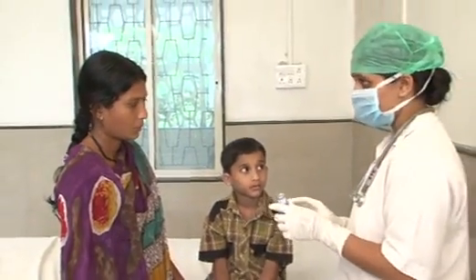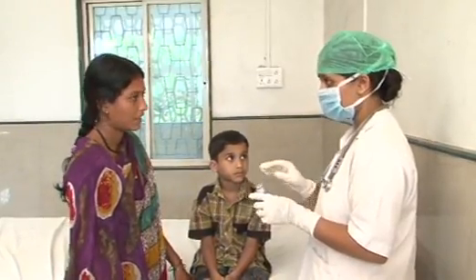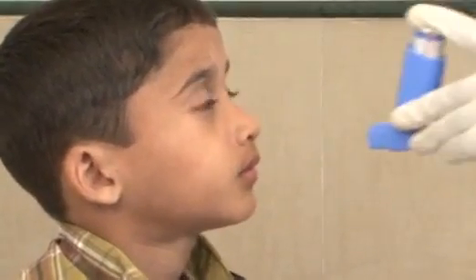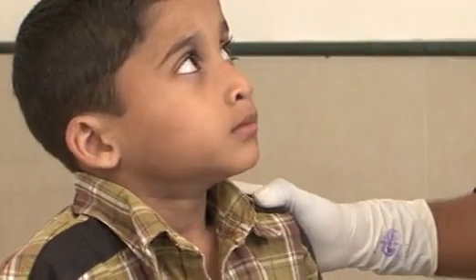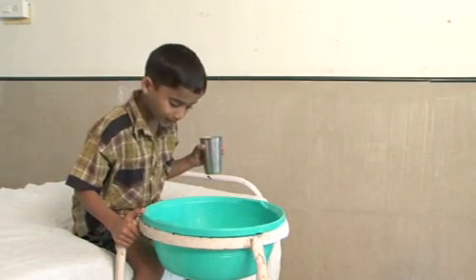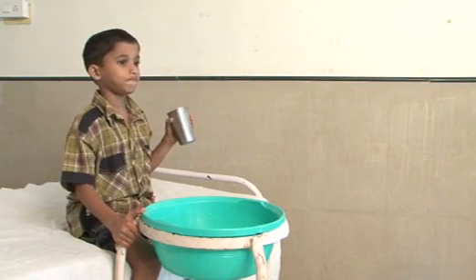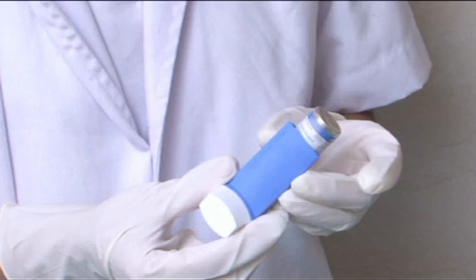Repeat the above steps when more than 1 puff is prescribed. Advise to wait 1 minute between puffs. This may improve penetration of the second puff dosage into the lung airways. Ask the older child to rinse his or her mouth with water after using the MDI. Recap the MDI.